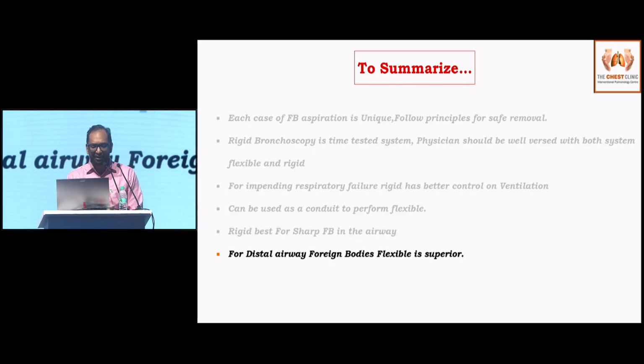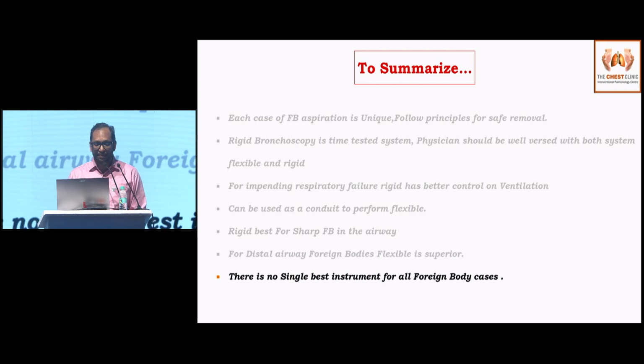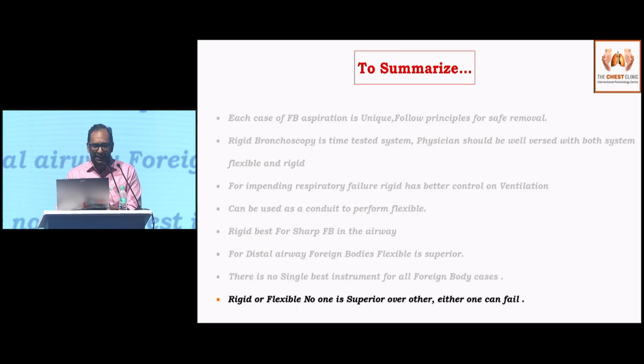For distal airway foreign bodies, rigid has a drawback and flexible is superior. And I believe there is no single best instrument for all foreign body cases. Rigid or flexible, both are on par with each other.